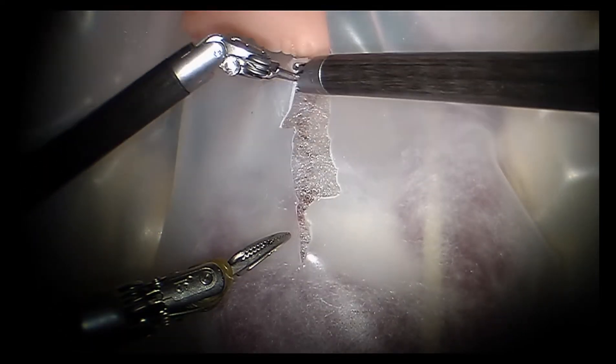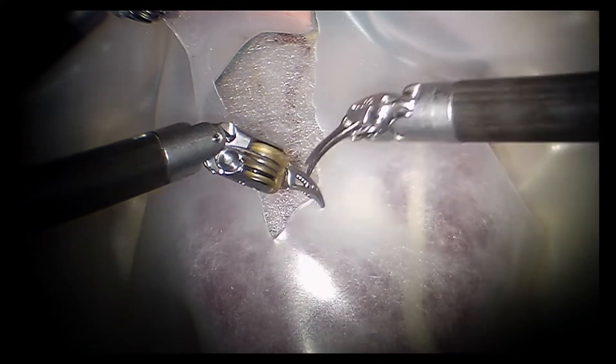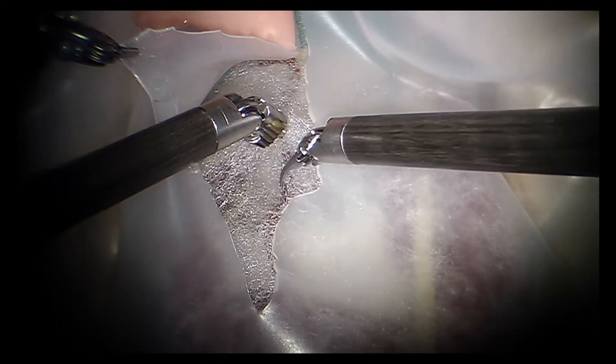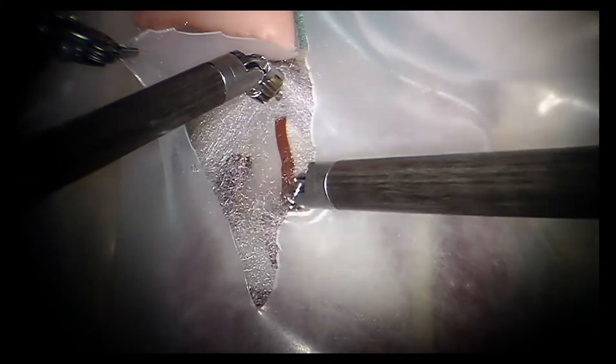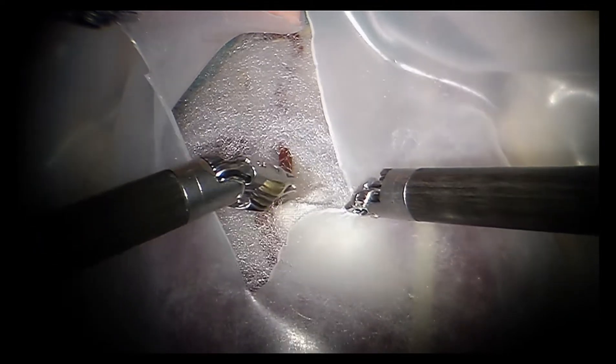Medial to this, the sacrum can be palpated, and the peritoneum overlying the presacral space is grasped, elevated, and opened. Extending this incision both caudally and cephalad exposes the presacral space. The areolar tissue is then dissected away to identify the location of the anterior longitudinal ligament near the S1 and S2 sacral vertebral bodies.